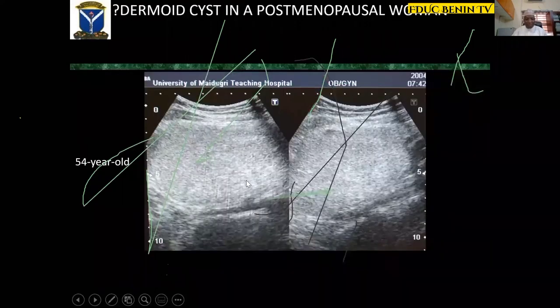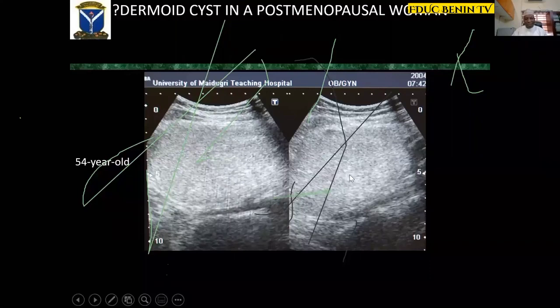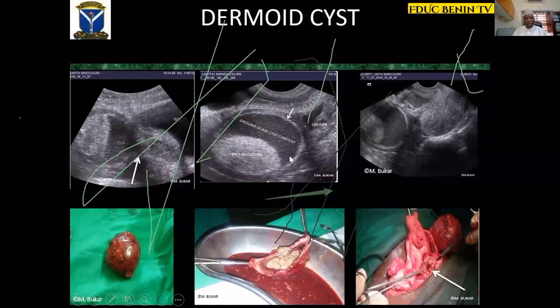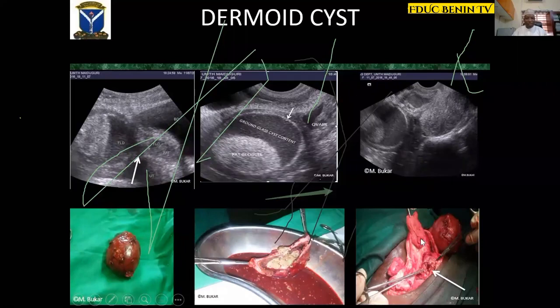In 8 to 10% of cases, dermoid is seen in postmenopausal women. A 54-year-old managed for advanced cervical cancer had an incidental finding — overlying the iliac vessels (the GPS) was the ovary; all you can see is an echogenic area with a dot-dash pattern, suggesting fat and hair. Fat-fluid level is seen in about 30% of cases of dermoid. All features of dermoid — fat, hair, and shadowing — are illustrated here. Malposition of a structure is an important feature of ovarian torsion. In 50% of cases, the pain of torsion is minimal or mild. If you see any structure in an abnormal location, please ask questions — you may get pointers to your diagnosis.